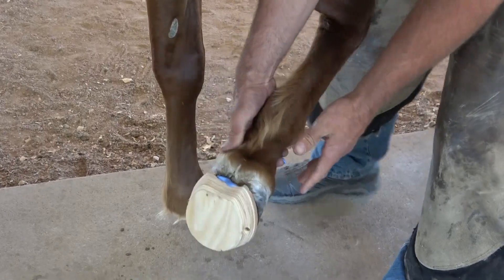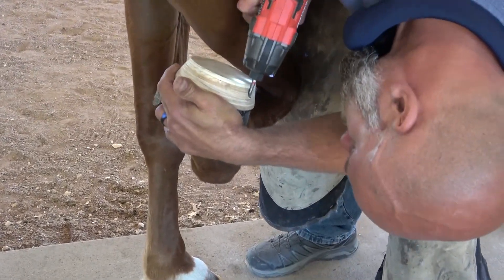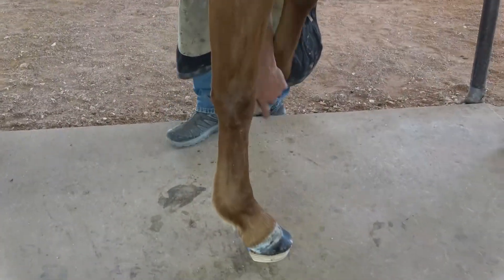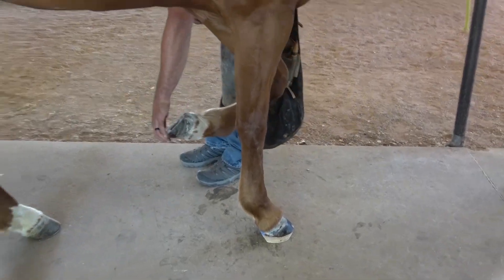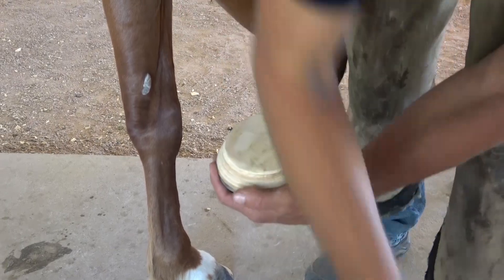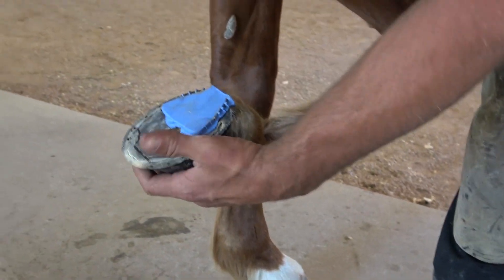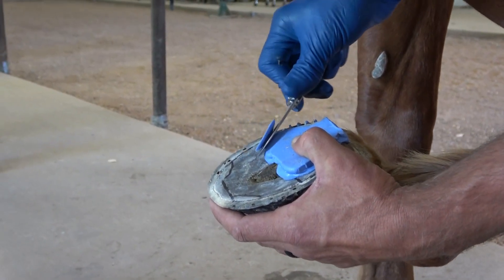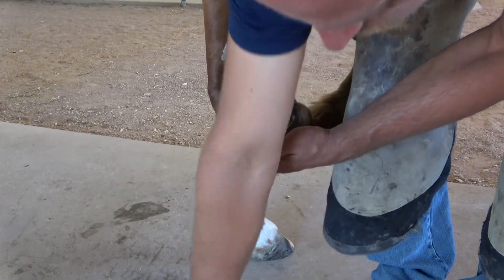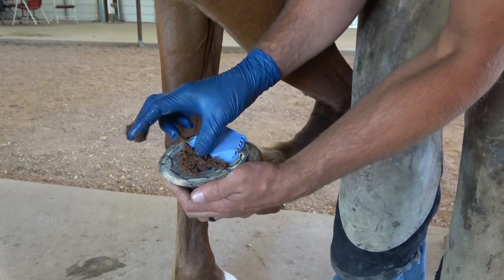So we have created a pressure plate — this is just going to sit up. We can now make sure that we don't have any extra pressure on the sole here, shaving off any high spots. Here we are using magic cushion, and this will help harden the sole.